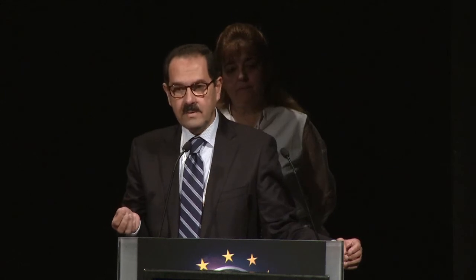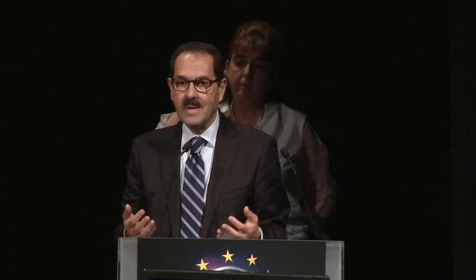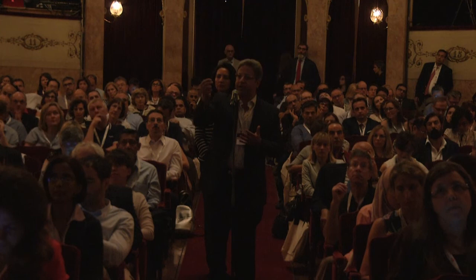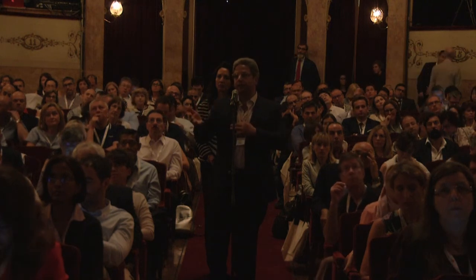One view is that cells proliferate on the ILM surface. The other view is that in these cases the ILM may be rigid for reasons we do not yet know. But the intraoperative finding is that once the ILM is removed, this rigid retina becomes more mobile and can be attached much more easily. In the postoperative period, the retina on the next day is completely attached, and in two years of follow-up there has been no single recurrence. Have you noticed any difference in ILM texture or thickness between diabetic attached retina and detached retina in myopic macular holes?